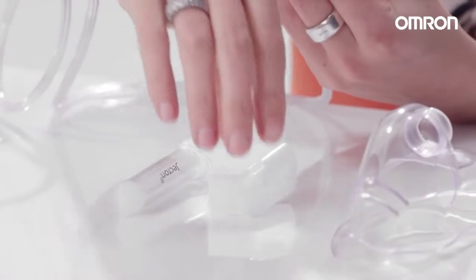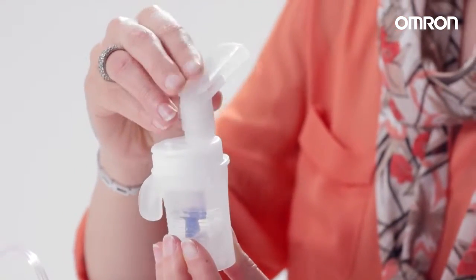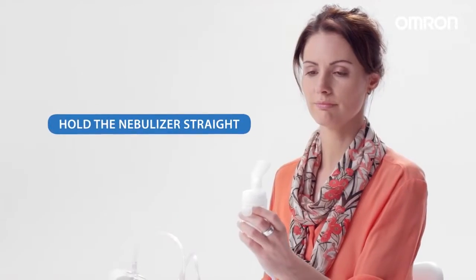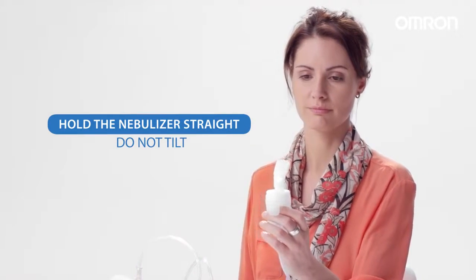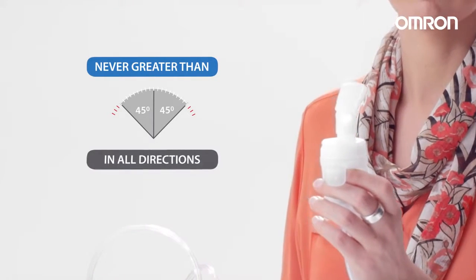Attach the kids accessory, mask, or mouthpiece to the nebulizer kit and attach the air tube. Hold the nebulizer straight and do not tilt the nebulizer kit so that it is at an angle of greater than 45 degrees in all directions.